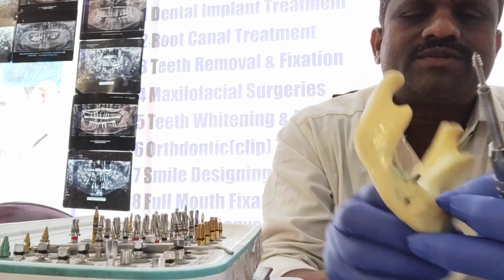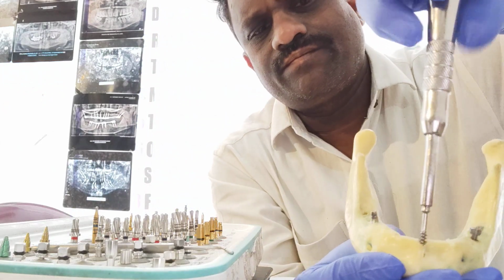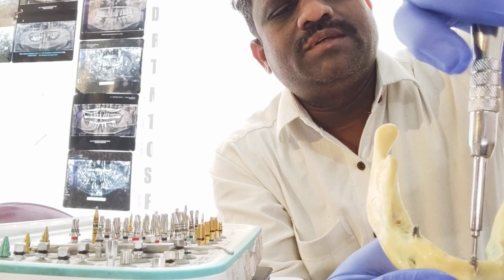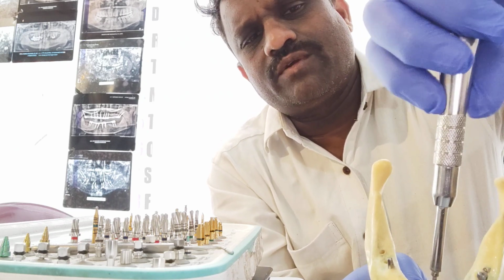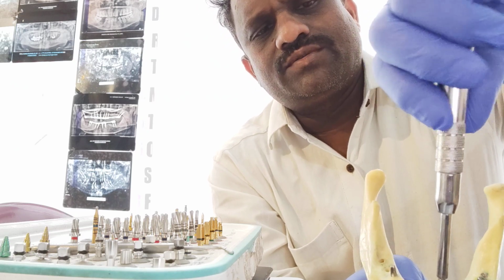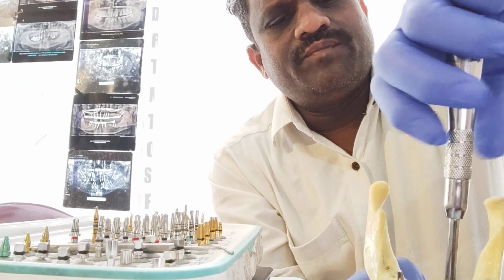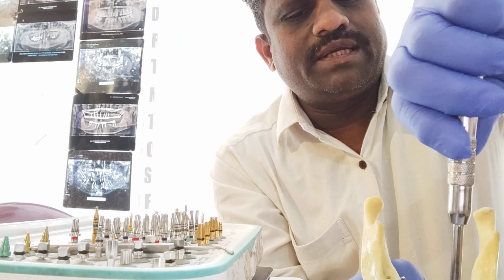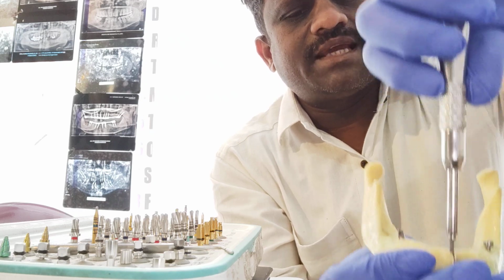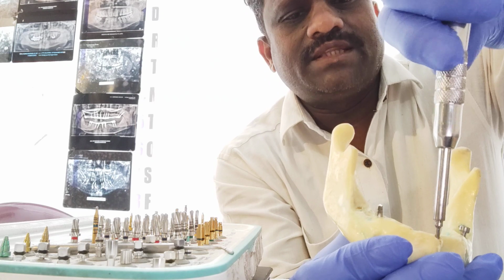So osteotomy has already been done here. I'm placing it. Have a look. However you are comfortable, you can hold the driver. So this is favorable for me. This driver is very good for me. See, it has started to go inside the bone. It has crossed the cancellous bone. It is engaging in the corticals.